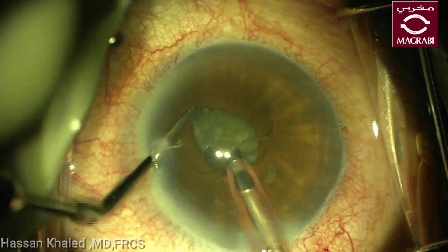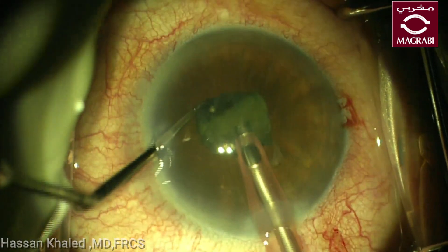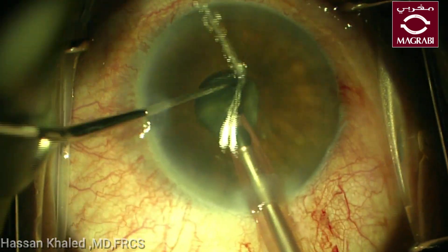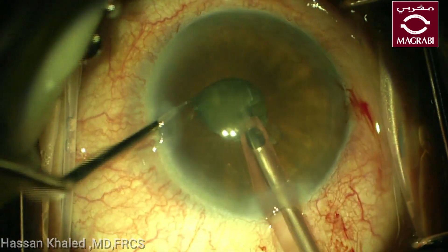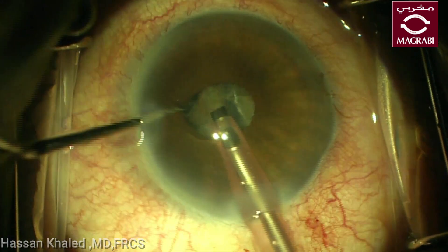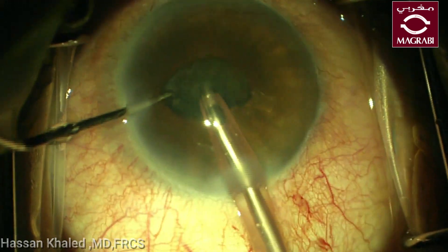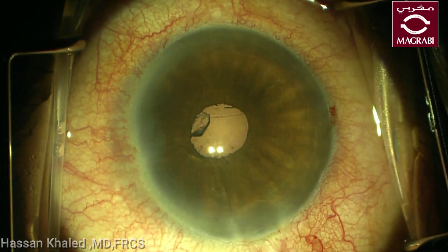You can see the pupil is narrower than before. All your work should be at the level of the pupil, at the center of the pupil. After chopping the nucleus into smaller pieces and emulsifying each piece alone, you can see this is a protective shell. By the end of the surgery you can just aspirate it with slightly ultrasound power.